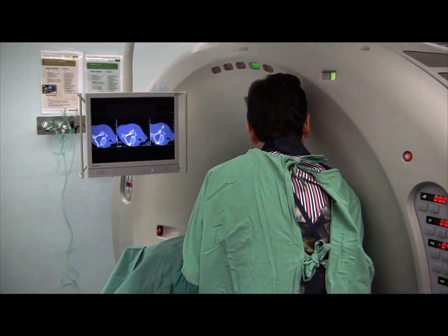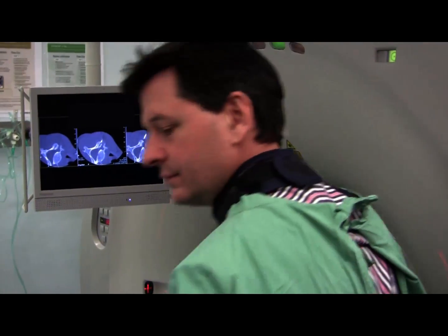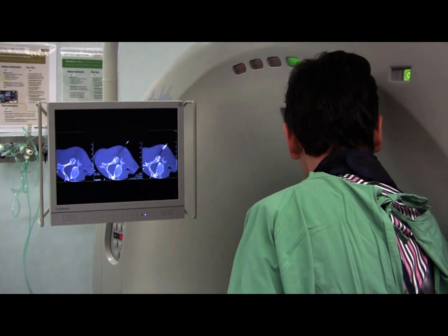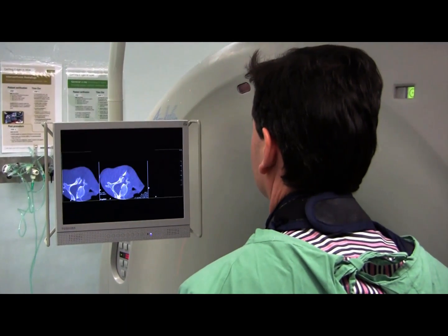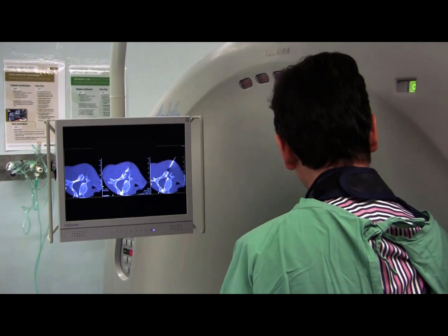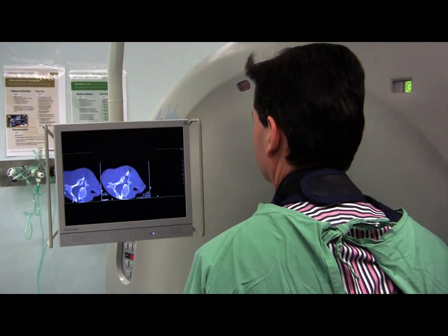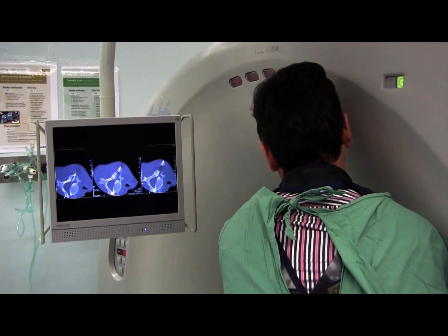What we're doing now is exchanging the local anaesthetic needle for the 25-gauge spinal needle. The 25-gauge local anaesthetic needle was used to put local anaesthetic down to where the 25-gauge spinal is going to go. The 25-gauge spinal has a longer reach and an angled tip. There's a series of taps with the foot pedal on the fluoro CT system to show where the tip of that needle is — three images: one towards the patient's feet, one in the middle, and one towards the patient's head — to adjust the z-axis position. These are contiguous one-millimetre slices, so the distance from the lowermost to the topmost image is only three millimetres. This is precision placement.